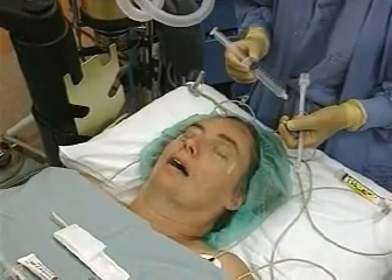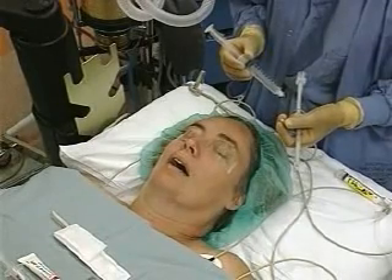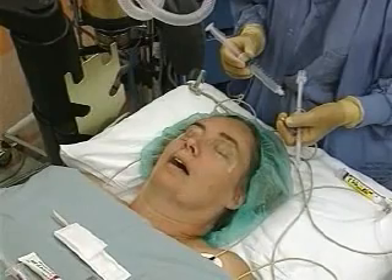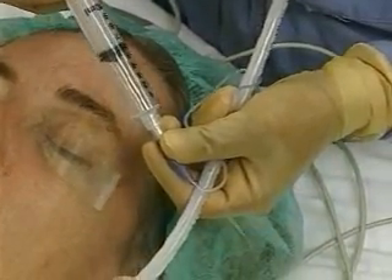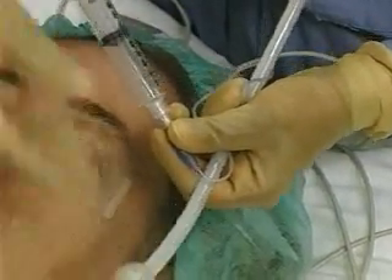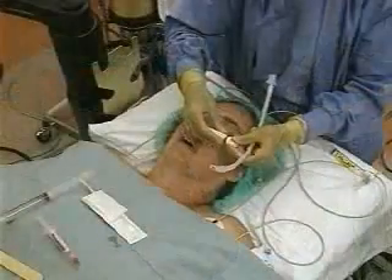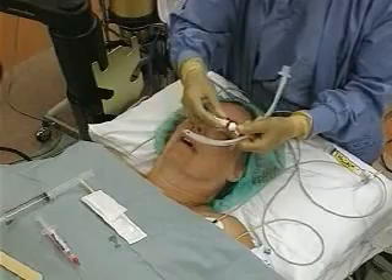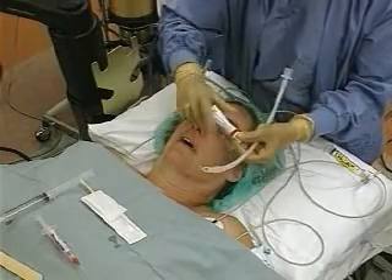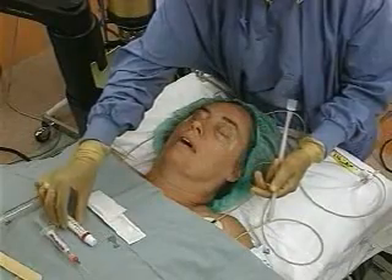Nasal intubation is generally done in the awake spontaneously breathing patient when there is an advantage to avoiding laryngoscopy, such as with a cervical neck fracture. Check the endotracheal tube cuff for leaks by inflating and deflating the balloon with 10 milliliters of air. Coat the end and cuff of the unstyleted tube with viscous lidocaine jelly. If warm saline is available, the tube may first be soaked for three minutes before the procedure is performed.